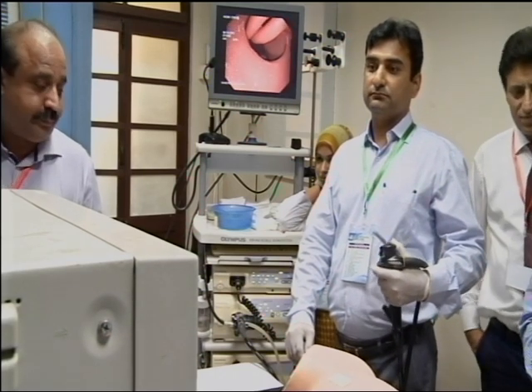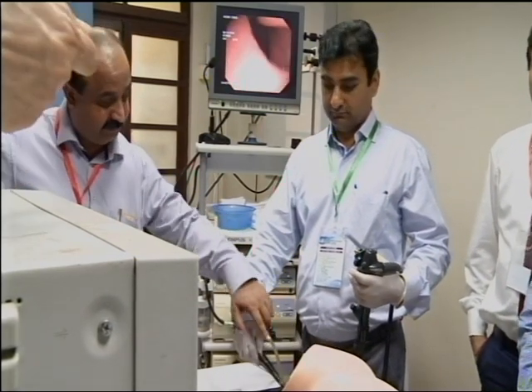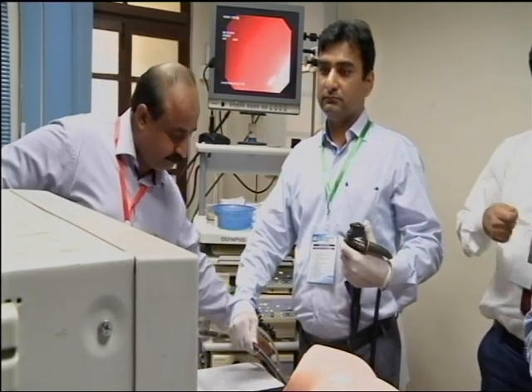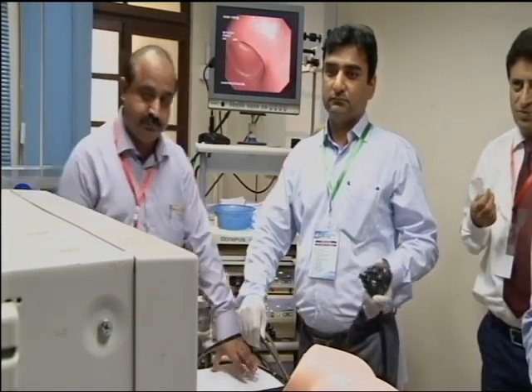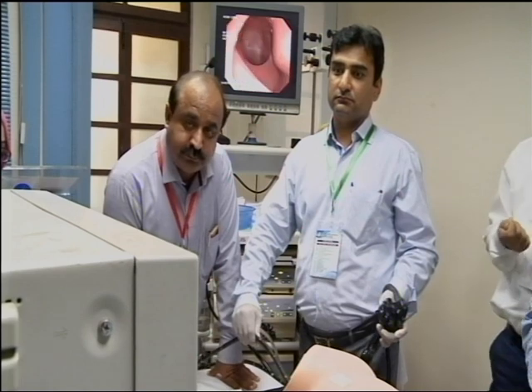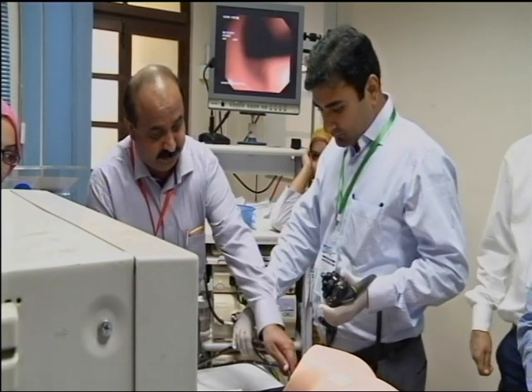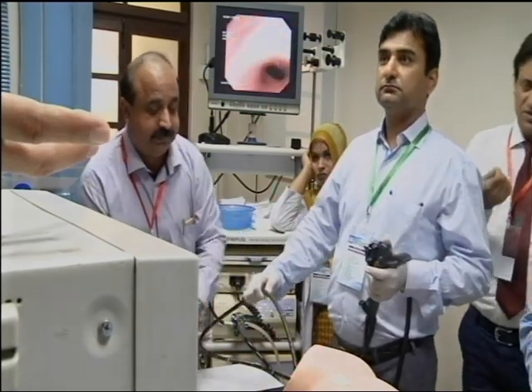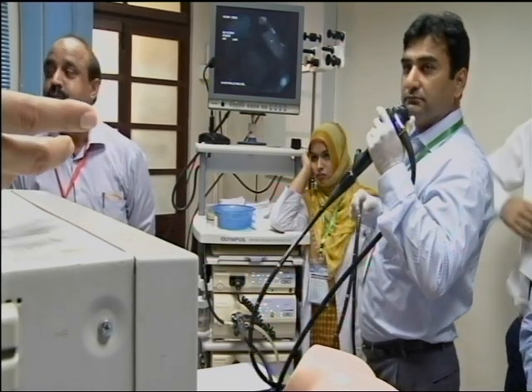And all this, I simplify for you. There are very limited movements you can do in colonoscopy. You can advance, you can pull back. You can torque clockwise, you can torque anti-clockwise, too. You can use the big wheel, up, wheel down. Okay? Well, it's one-to-one movement. And the small wheel really doesn't apply in most cases. It's only when you're in the right colon you want to get into this. Generally, you don't need the small wheel. So basically, you come down to how many moves? It's only 6 moves. There's nothing much to it.